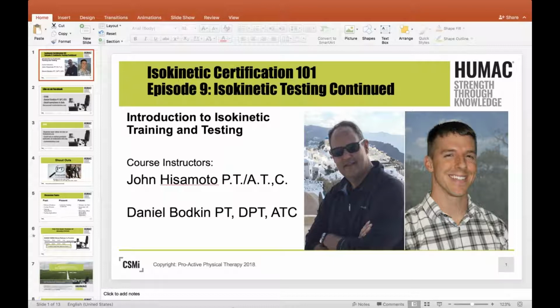And again, we are talking about testing. The big thing is, where do you want to test your athletes? Do you want to test them on the field, getting tackled, or in the clinic? I say we test them in the clinic. So let's go ahead and get started with our videos. First up, we're going to show you how to input a patient, how to write a protocol for the interrupted stroke test, and then we'll go into the interrupted stroke test.